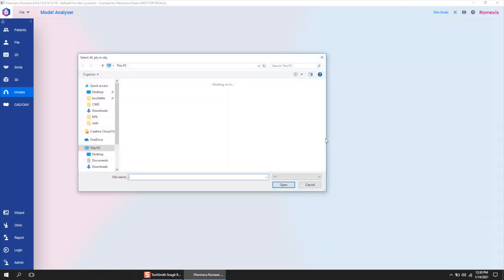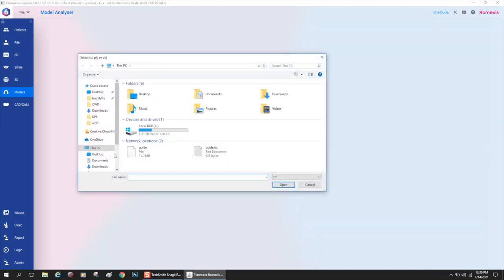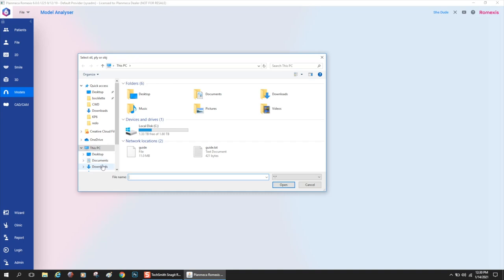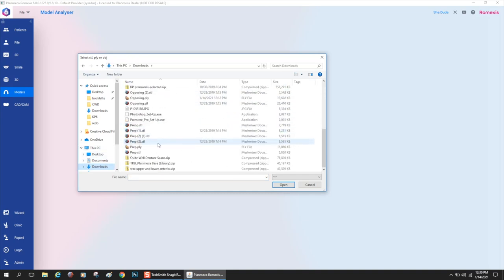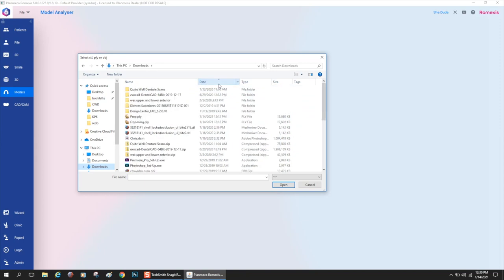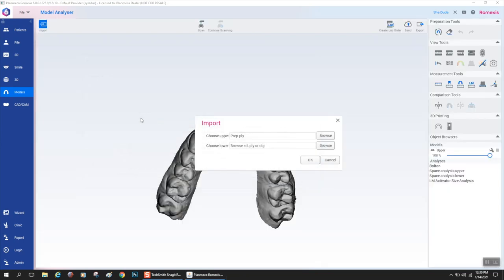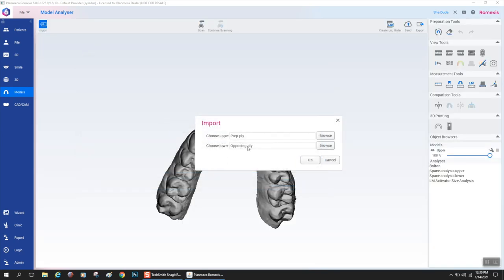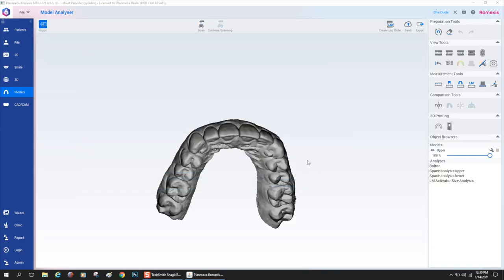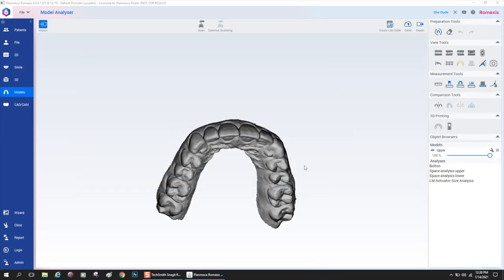But here I'm going to import some ply files from a case that I did. It takes STL, it takes ply, it takes OBJ. If you want the color, ply and OBJ are typically the color files. I do recommend working with color in model analyzer because you get a lot of really cool photorealistic views. I selected those ply files and now they're going to pop into the software.